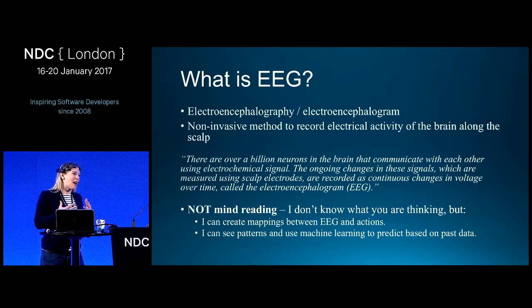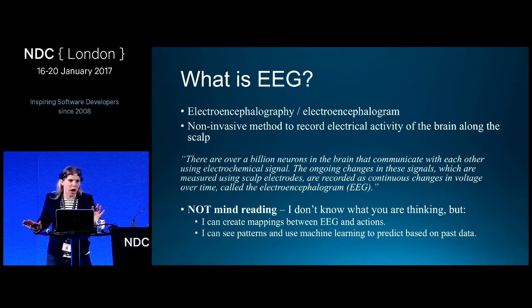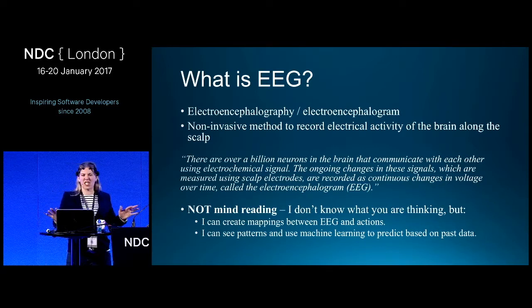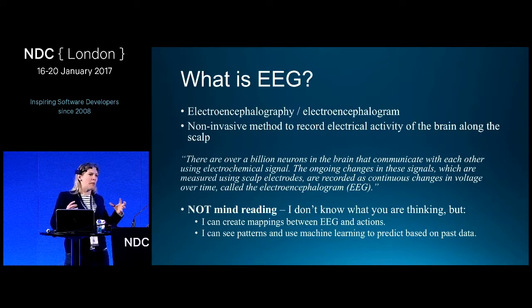It's really funny. Every single demo that the Emotiv company has done publicly, they always use a bald guy. Always, because bald guys are just easy. You just stick them on and it works, and bam. With me, it's this 20-minute long process of putting it on and adjusting chunks of hair around to get a good signal reading. So a little bit more complicated.